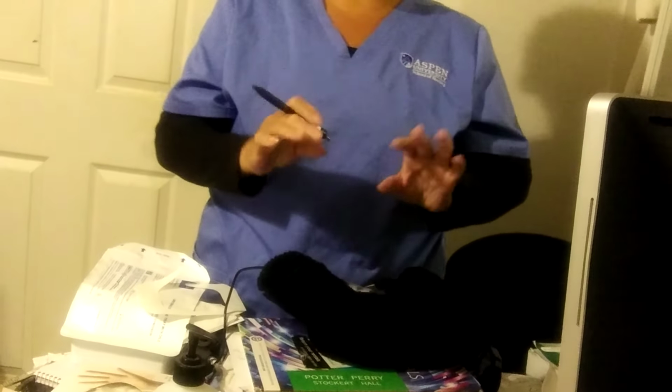Okay, and that is how you change a central access device dressing. Thank you.